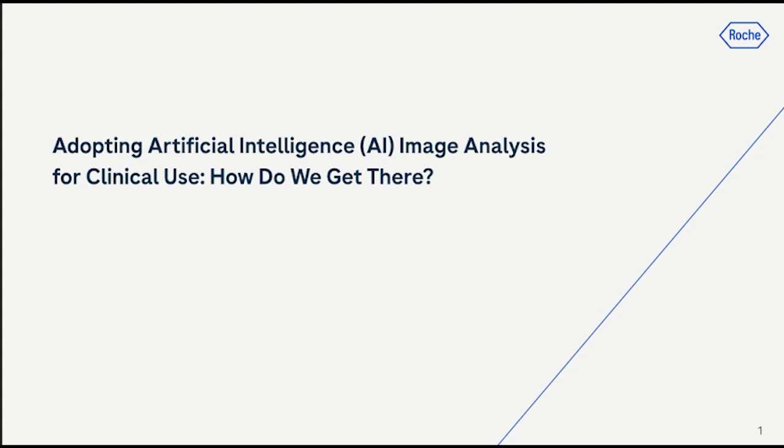But nevertheless, there are AI tools that can actually provide a lot of value to assess the quality of the tissue and the quality of the scan. And I do think, again, they have a little bit of a ways to go because they do not necessarily subclassify the type of quality issue, such that it's really up to the lab to decide if the slide has, quote, poor quality based on an AI.